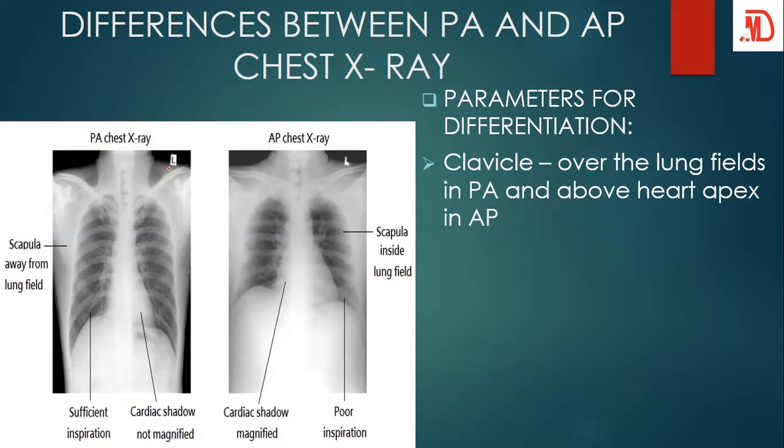So now let's look at it over here. Look at it, this is the clavicle, very nicely. You see it is coming into the lungs. So we say it has covered the lung field, or it is over the lung field.